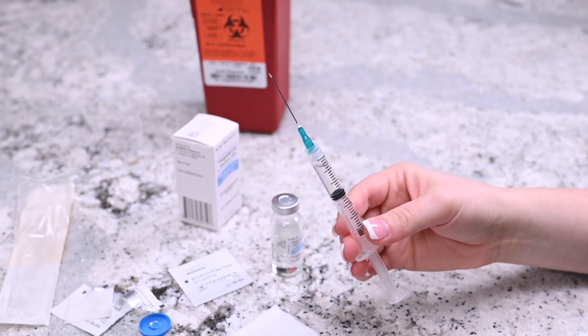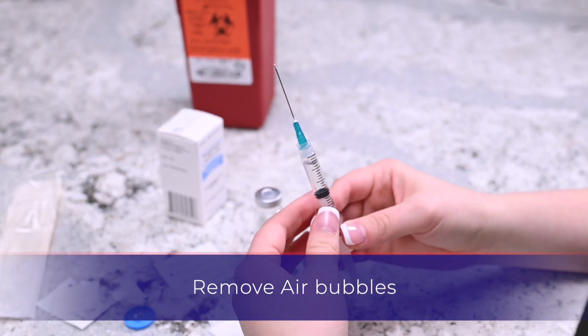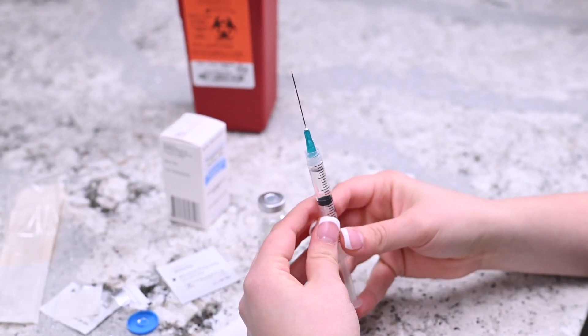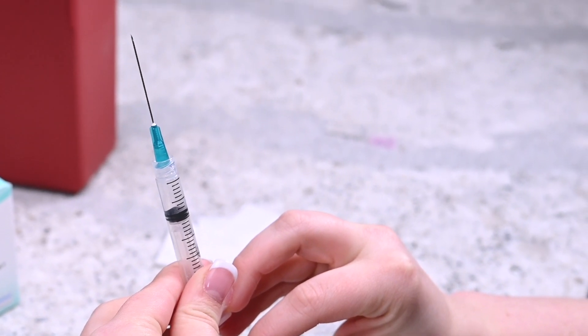While holding the needle upright, gently tap the side of the syringe until the air bubbles migrate to the top. Apply slight pressure on the plunger until a drop of liquid appears at the tip of the needle.